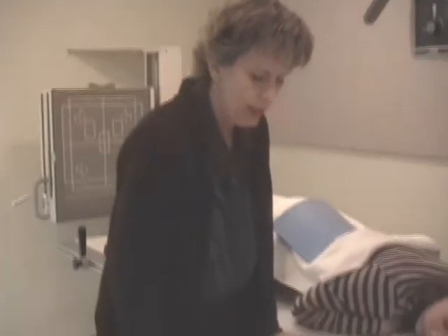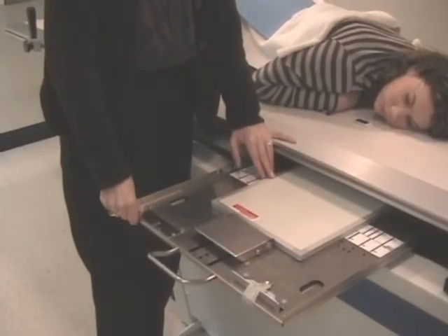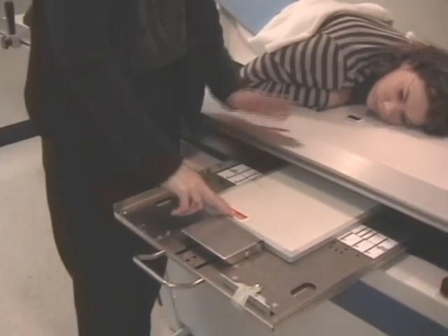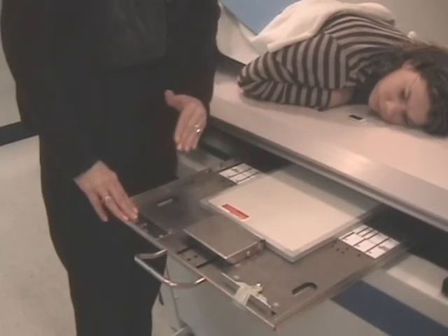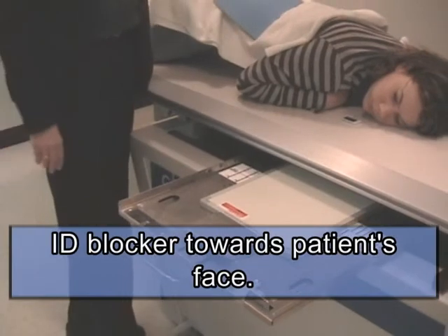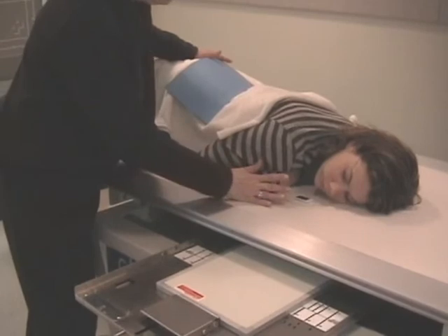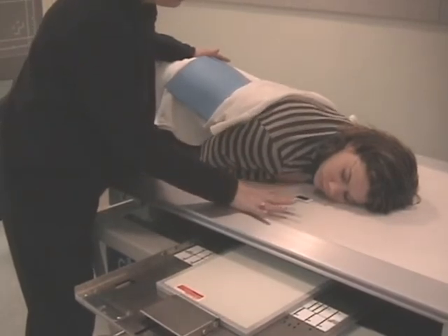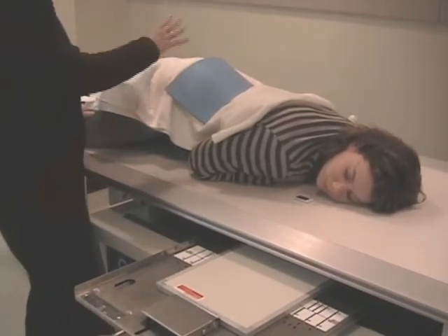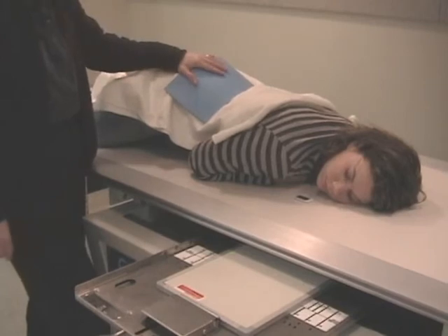If you look at the Bucky tray, you'll see that I have changed the cassette to crosswise mode. It's the same cassette size, 10 by 12, crosswise. The ID blocker will be towards the patient's face. The patient is in an LAO position. The left arm is down to their side, the right arm is tucked up, and it can be under her chest, where she's more comfortable, or out to the side. Then the right hip is elevated with the right knee supporting the leg, and I readjusted the lead strip.